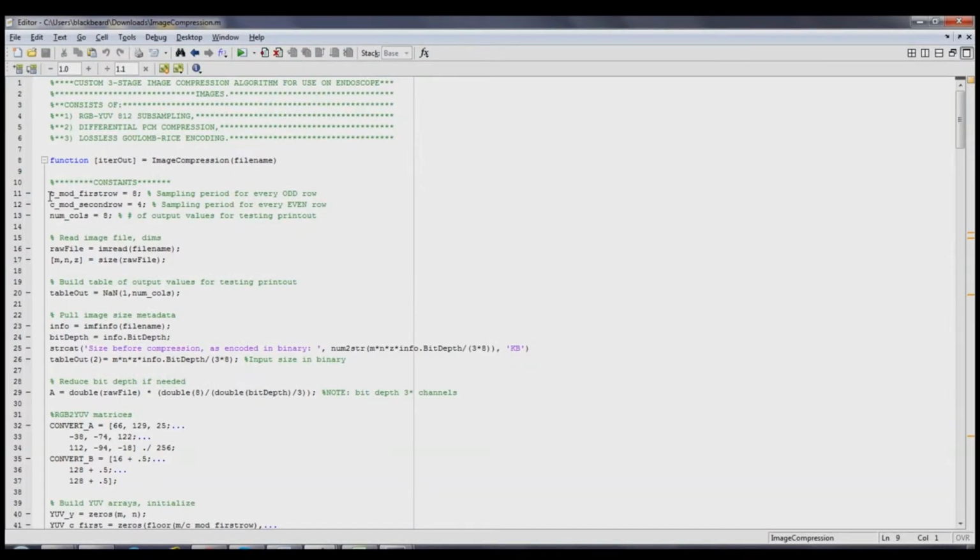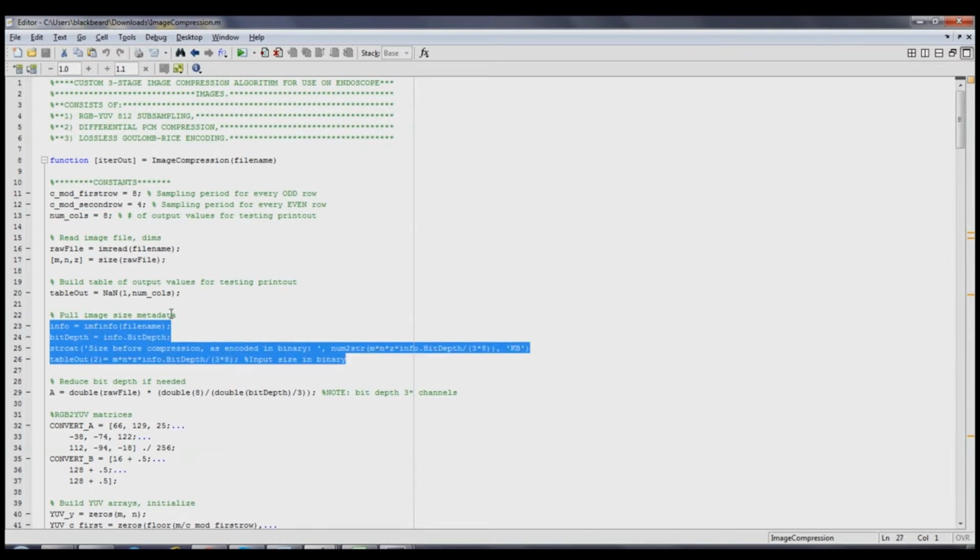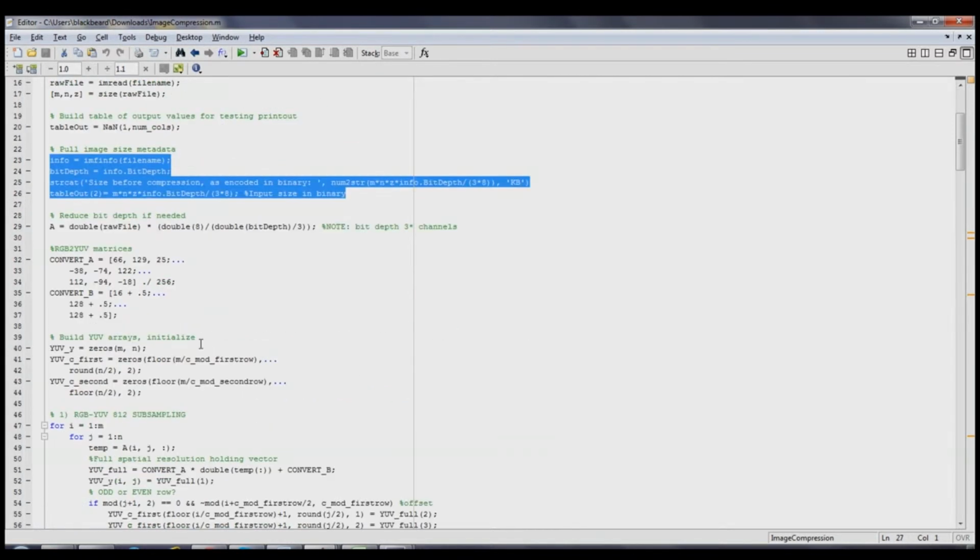Alright, so now I'm going to walk you through our code. So here's line 11. Khan optimally selected 812 as the subsampling rate. So every 8th pixel is sampled in every odd row, and every 4th pixel is sampled in every even row. Next, we query the image metadata and initialize an output table for benchmark values. Since Khan's algorithm is optimized for 8 bits of information per channel, we reduce the bit depth if necessary.